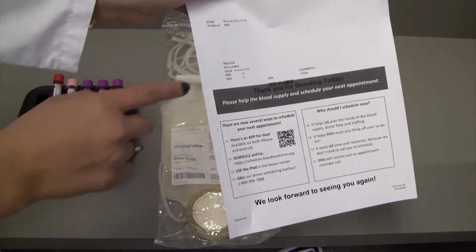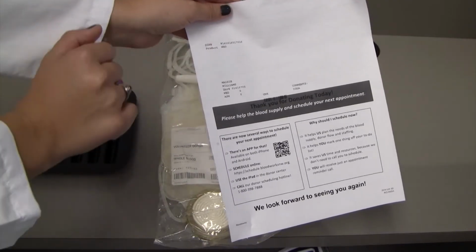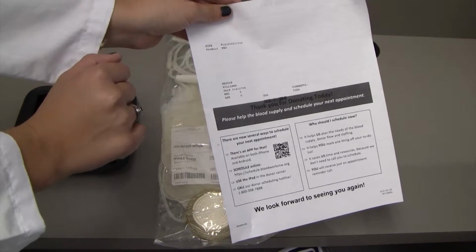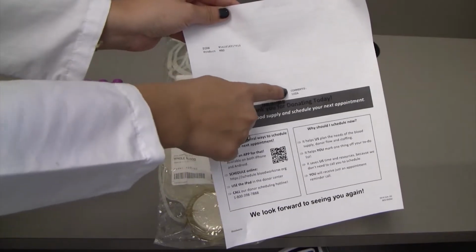Verified donor's name matches the donor sheet. Verified product is WBD for whole blood. Verify there's no special donation paperwork. Review donor sheet for donor comments.